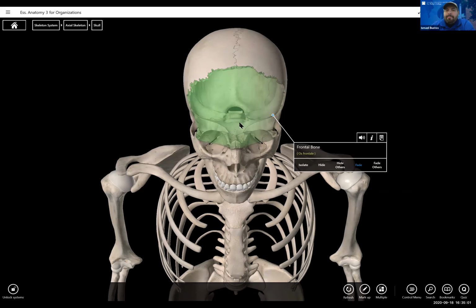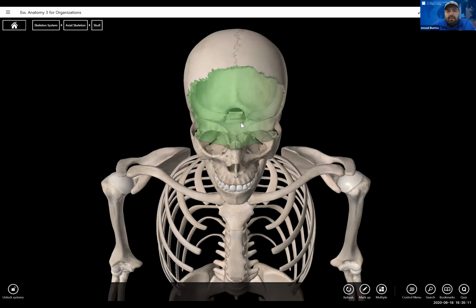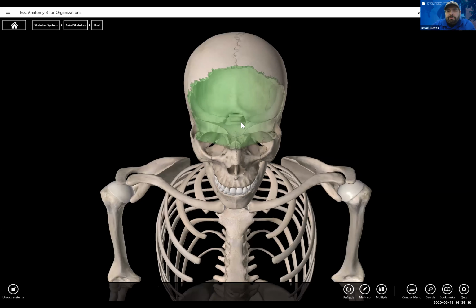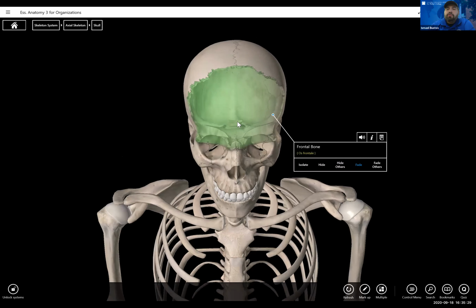All right, now what happens if you don't angle enough, right? Remember, you're the CR looking down. So if you're not angled enough, you're going to come more towards this side of the patient, right? So what happens to that dorsum sellae as you decrease your angle? You see it go superior to the foramen magnum. All right, that's one way. But if you're angled correctly like this right here, but the patient decides to extend their head, bringing their head back, again, what happens? The dorsum sellae goes above the foramen magnum. So those two things are going to happen, and it's going to cause that dorsum sellae to go above the foramen magnum.